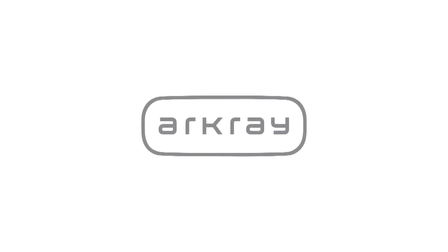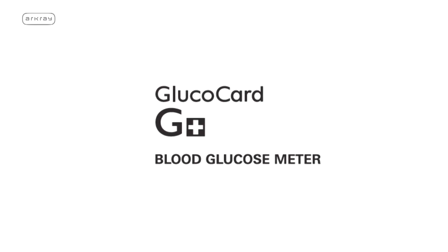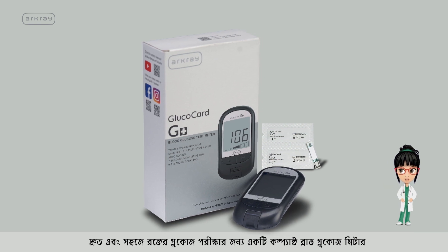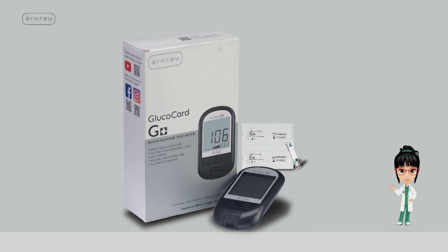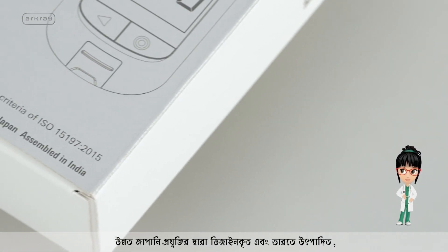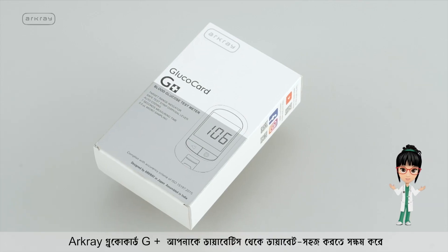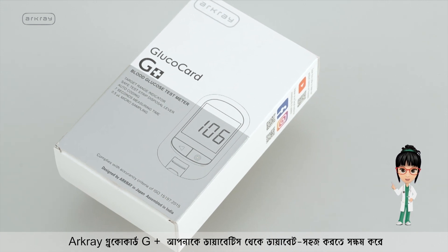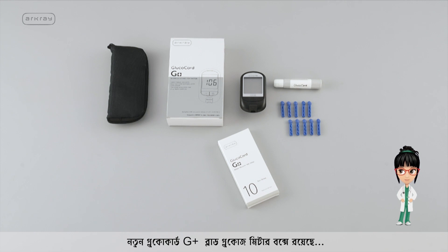R-Cray, one of Japan's leading diagnostic companies, brings to you the R-Cray Glucocard G Plus Blood Glucose Meter — a compact blood glucose meter for faster and easier blood glucose testing. Designed with advanced Japanese technology and manufactured in India, the R-Cray Glucocard G Plus enables effective diabetes management.